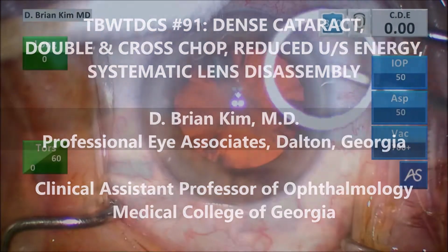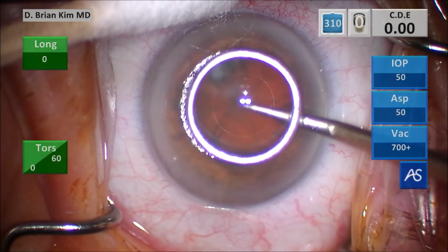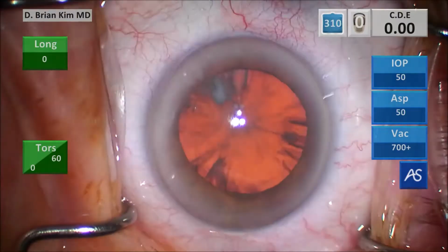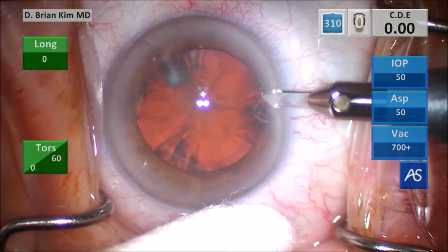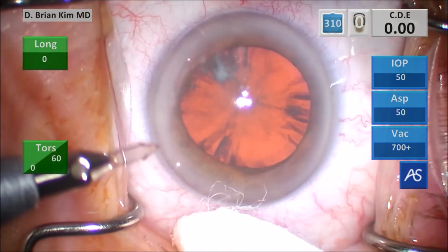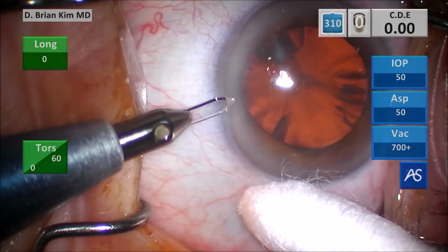So I'm using a cotton tip to steady the eye. I'm using a corneal marker, which will help me to center and size my rhexis. This is my paracentesis incision, first on the right side and then the left side, and make sure I'm parallel to the iris plane, which creates a nice corneal shelf, which will allow me to achieve a self-sealing incision.